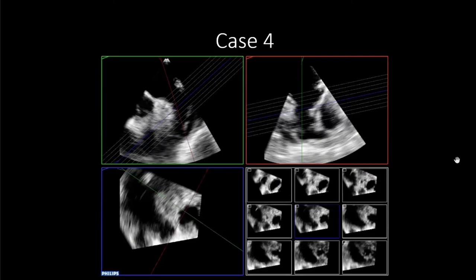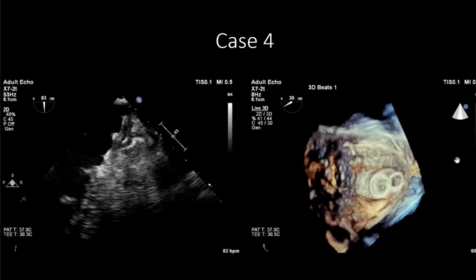This is what we do for 3D. Another way to assess the left atrial appendage, if you have a clean picture, is to take the eye slice — similar to what was shown for the mitral valve. You take your 3D data set, put your slices going parallel to the orifice all the way down into the left atrial appendage, and get a true measurement. You can also rotate it to go parallel to the length of the appendage and look through the entire appendage for any clots. This is one of the few true 3D volume-rendered images showing a device in place — you see the nice figure-eight shape of the occluder after closure.